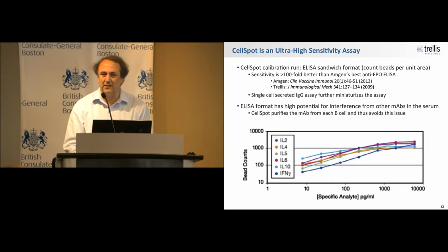It would have been obvious preclinically, or very early in phase 1, it would have been ruled out. So the kind of issues that the FDA is worried about, that the people in industry are worried about, they're inevitably going to be relatively rare antibodies. And so the question is, how do you get a really sensitive assay for them?